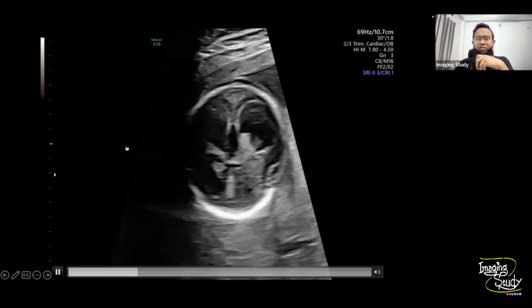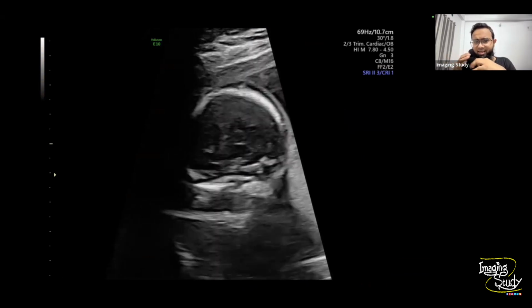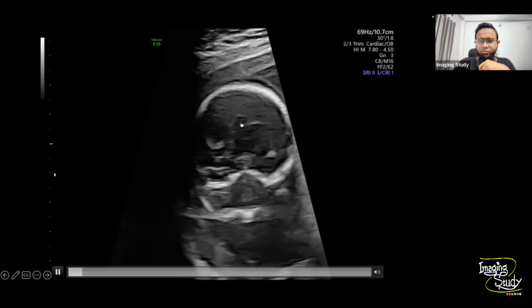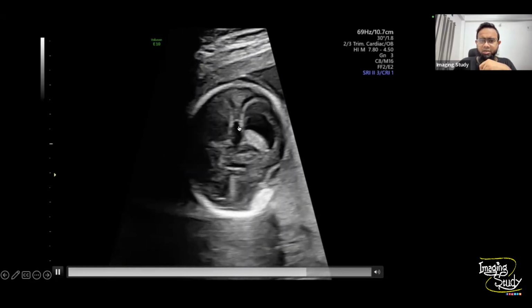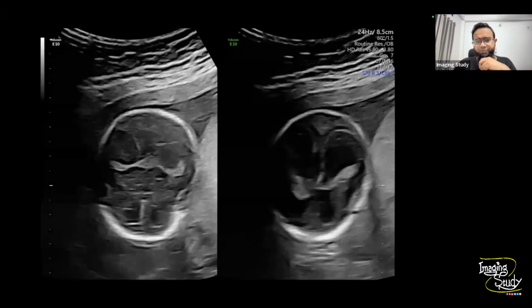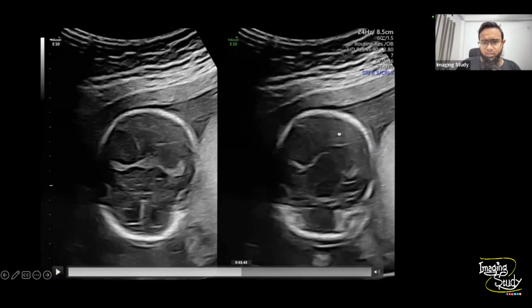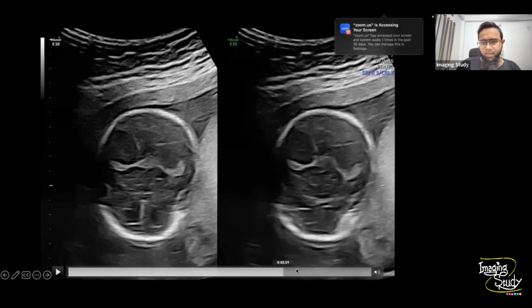Let me see it from a different angle. I have changed the cardiac setting. The cardiac setting is quite good to understand the abnormalities a little bit. So here we can still see the ventricles are slightly dilated, but I'm not pleased with the cerebellum. The cerebellar region doesn't look quite normal. We can't see it quite well, so I'm not satisfied. You can see this is the thalamus. Let me just show you. This is the cerebral peduncle here.